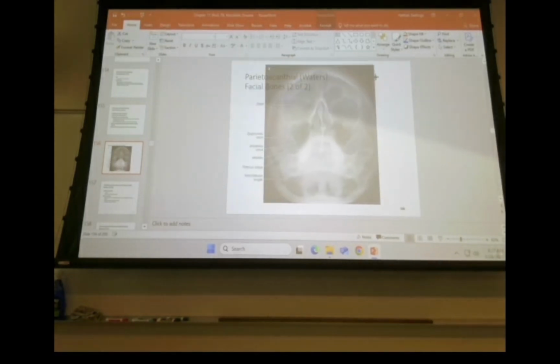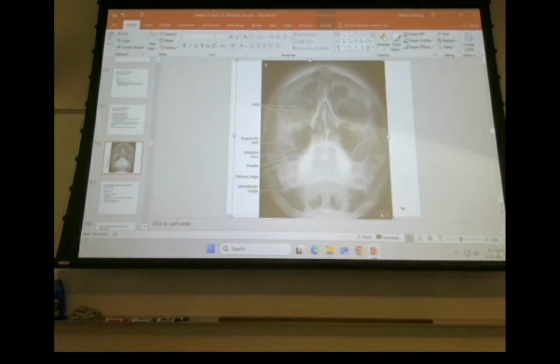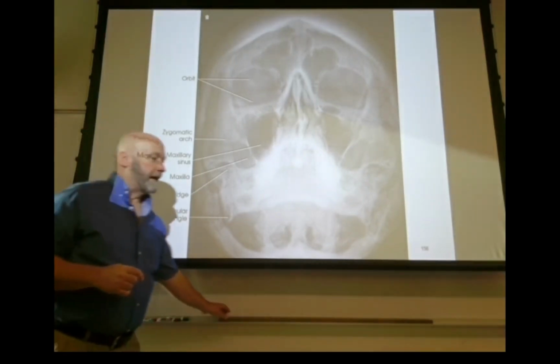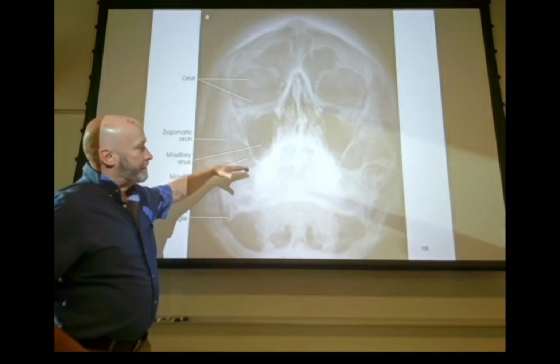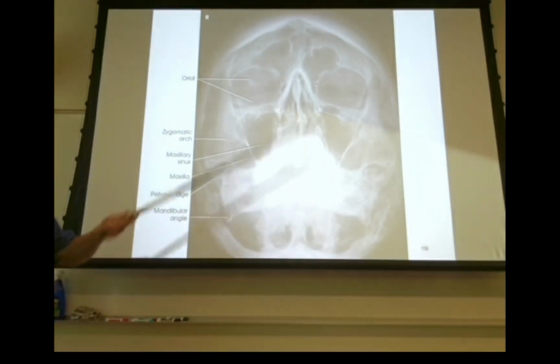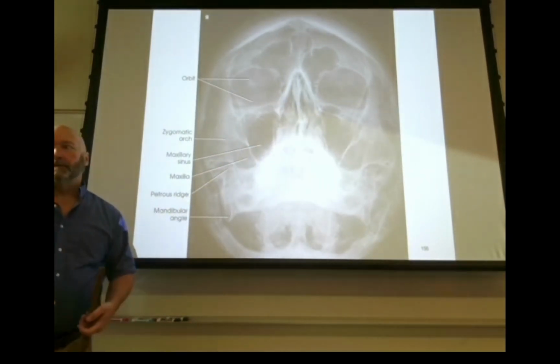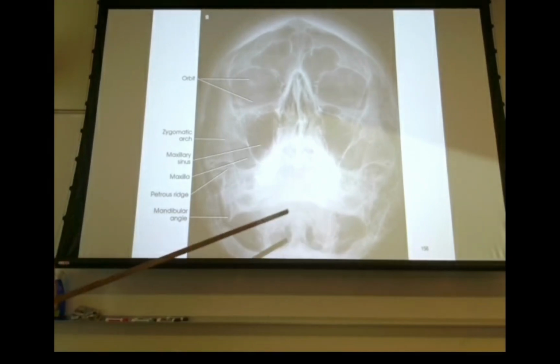So the 37 Waters shows us almost everything that you would want to see in a skull, facial bones, sinuses, whatever. It might not show everything ideally, but it's going to show you everything. All right, so 37-degree Waters, we tilt the chin back far enough to put the petrous ridges below the bottom of the maxillary sinuses. Can we see the maxillary sinuses now? Yes. Can we see frontal sinuses? Yeah, we can. Can we see the ethmoid sinuses? No, but you can't really see them anyway. They're going to CT.